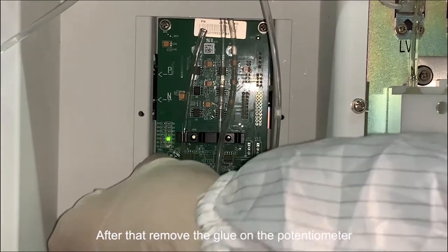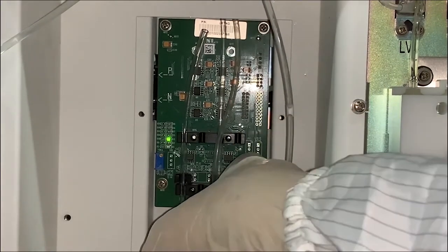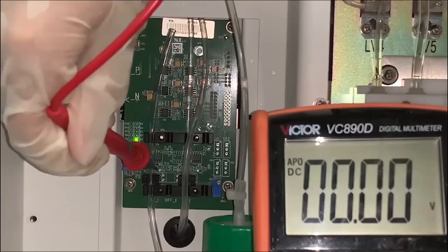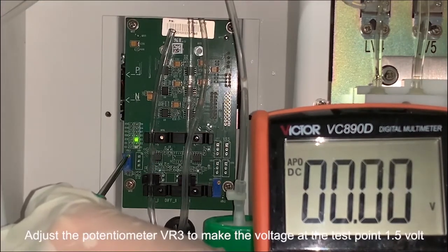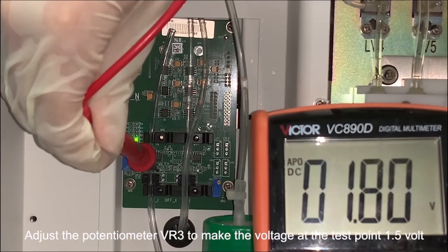After that, remove the glue on the potentiometer. Measure the voltage on TP1, which is for line 2. Adjust potentiometer BR3 to make the voltage at the test point 1.5 volts.